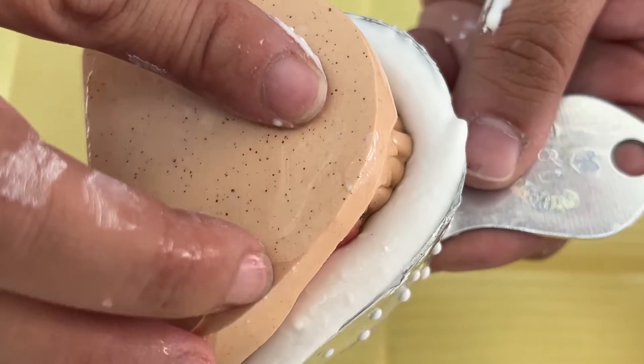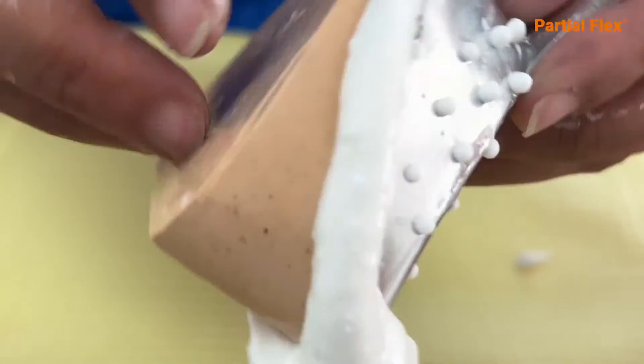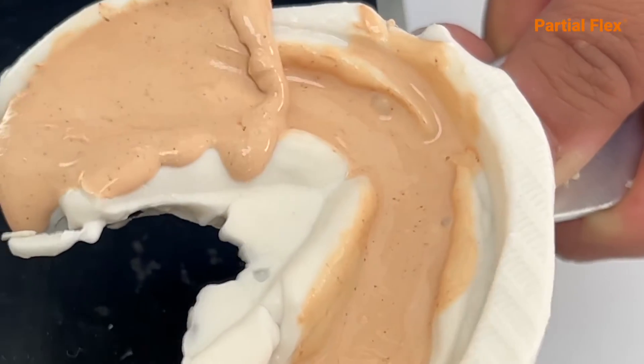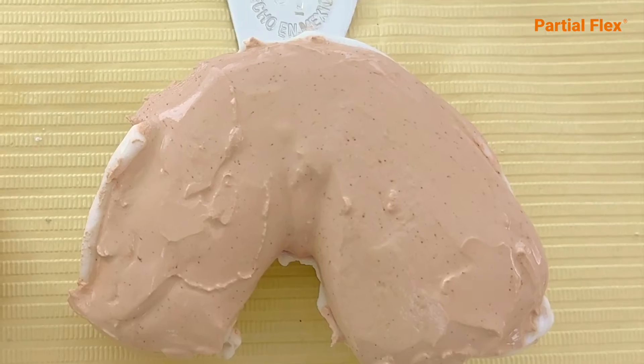Duplicate using alginate, silicone, or gel duplicator for plasters. Use partial flex type 4 plaster. Its stone is very hard and trustworthy.